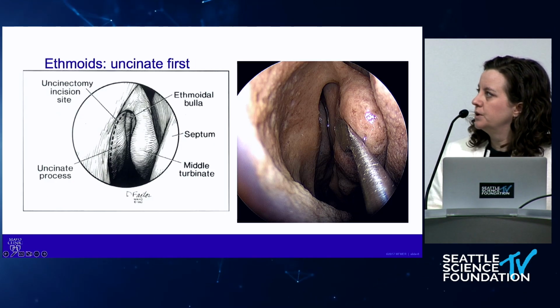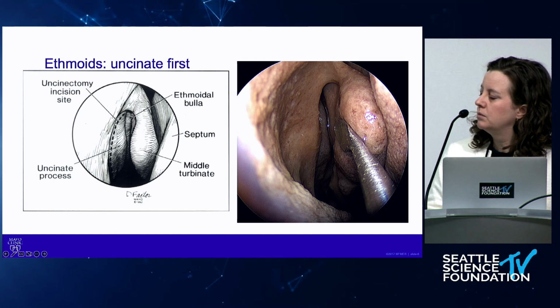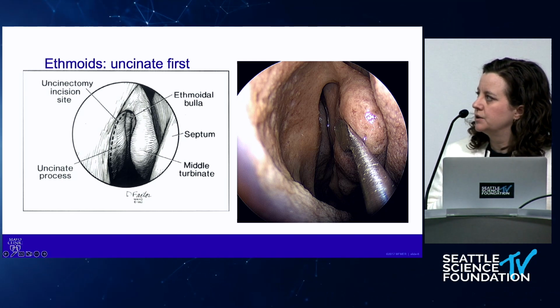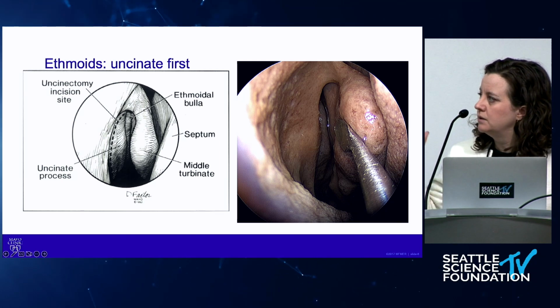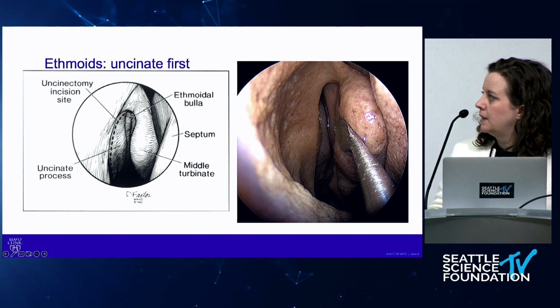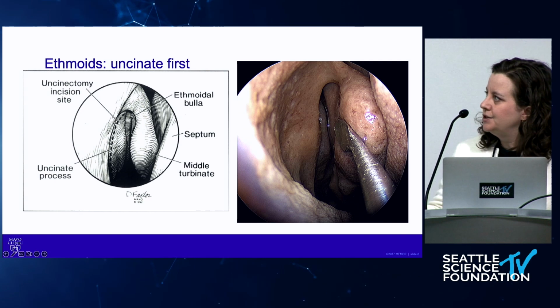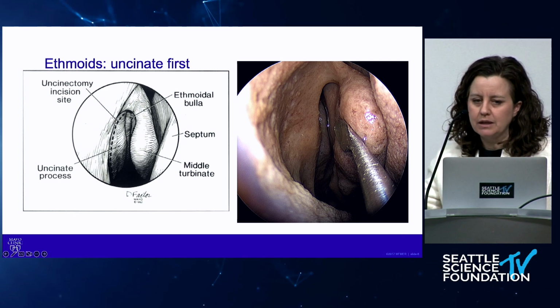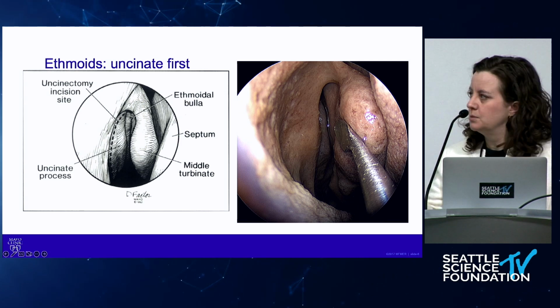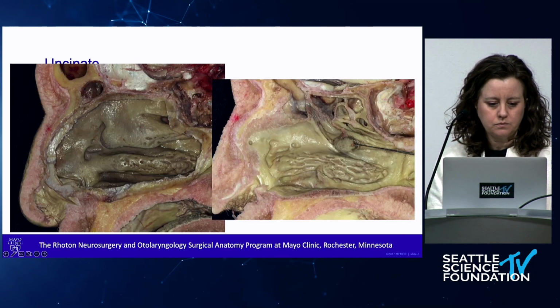So first, the uncinate, which we just talked about with the last talk, important for maxillary surgery, but also important for the ethmoids. Pushing that turbinate, you can see the uncinate, and then the bulla right behind it. I don't crank on that turbinate. I don't like to crack it. You can gently medialize it with your instruments while you're working.